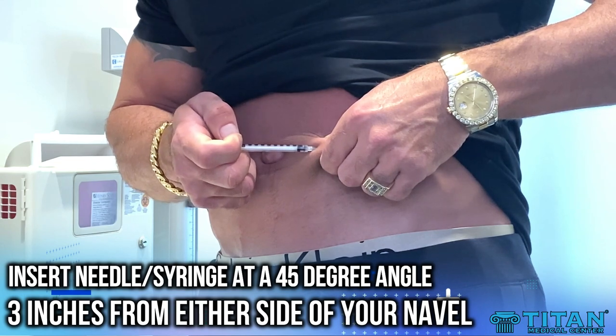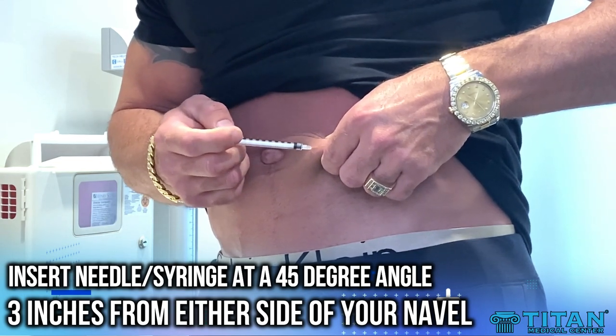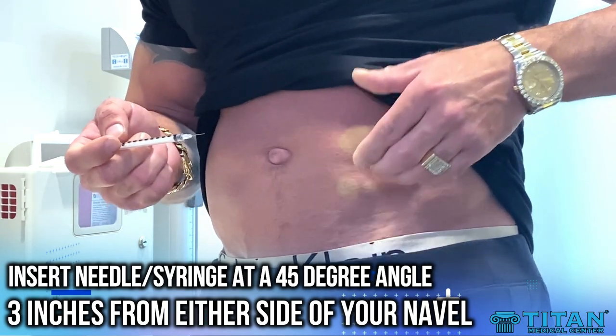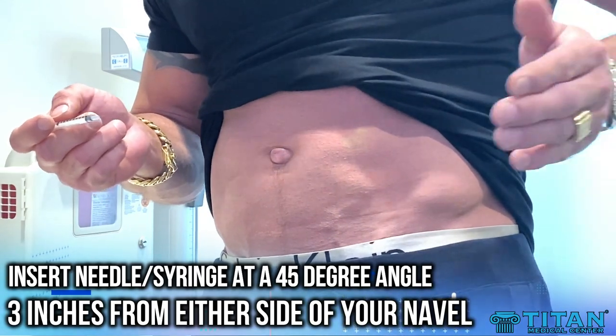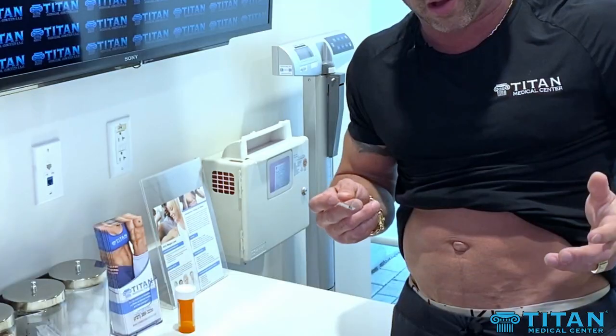So we're going to go at a 45-degree angle coming across, going right in, pulling right out. There shouldn't be any blood, or anything. If there is, you can wipe it off and that's not a problem.